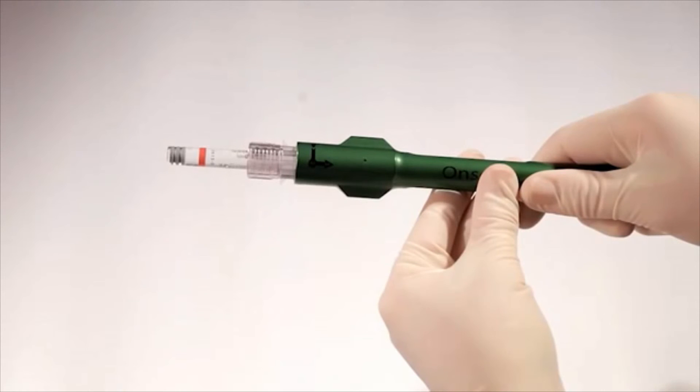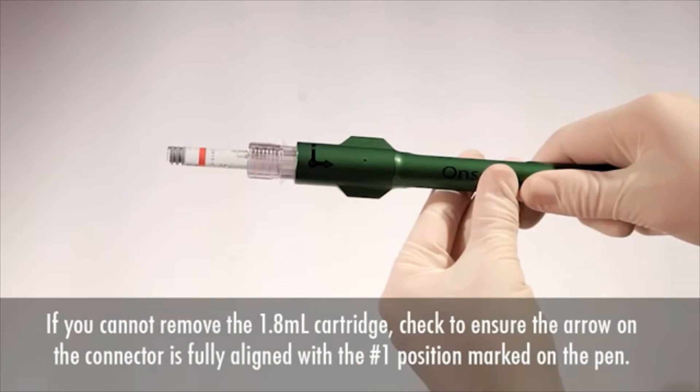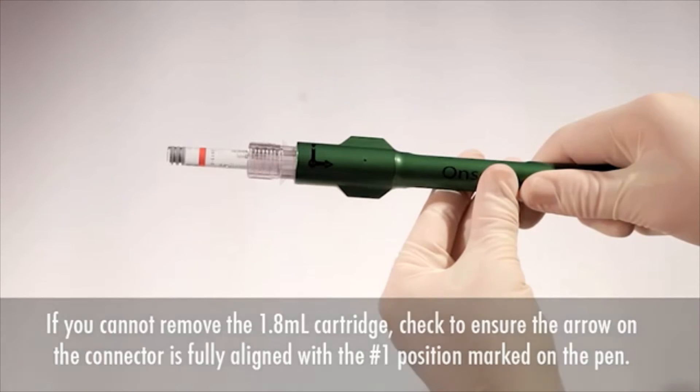If you cannot remove the 1.8-milliliter cartridge from the connector, you may still be in the number two position, or you may not have rotated the connector fully to the number one position. At any point other than all the way in the number one position, the 1.8-milliliter cartridge is locked and can't be removed.